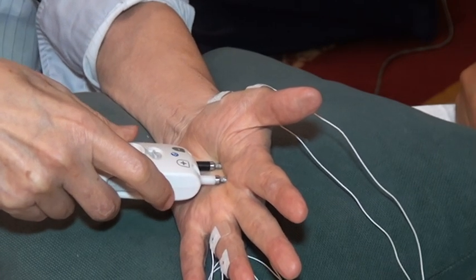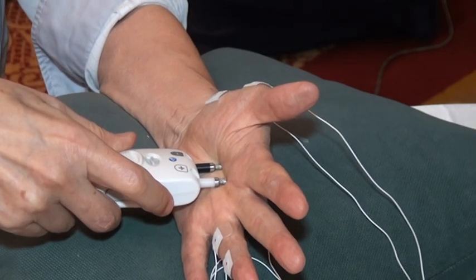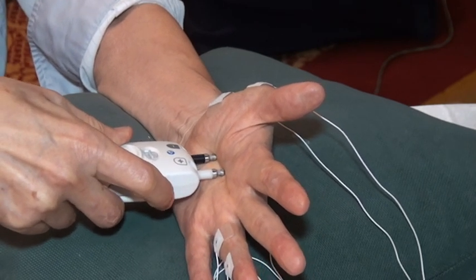Adduction. And then there's the response there. That's ulnar nerve, which we don't want, because we are doing median nerve. All right, I move 1 centimeter more proximally here.